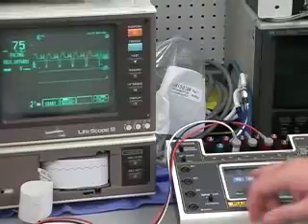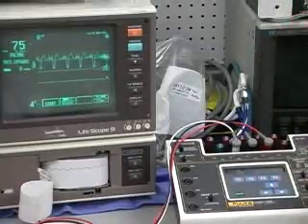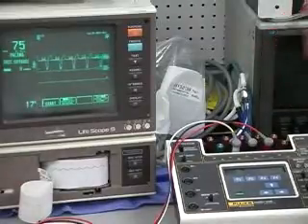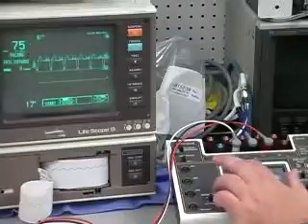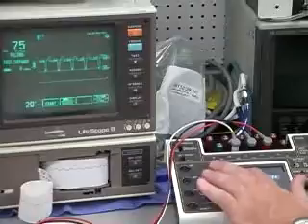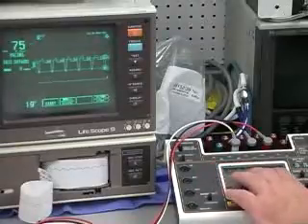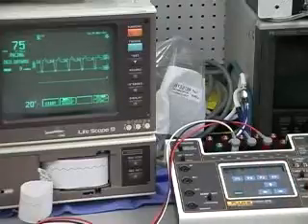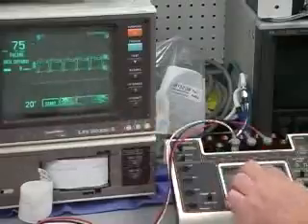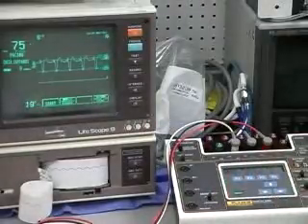And let's say a nurse or doctor is complaining, well, my monitor isn't picking up the pulses. I said, well, let's just give it a try. Let's go into amplitude. You can go in and bring those amplitudes all the way down, right there to nothing. And you can see it's fully erased. Now if you want to do it again, you can start.